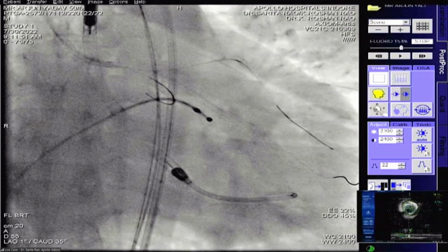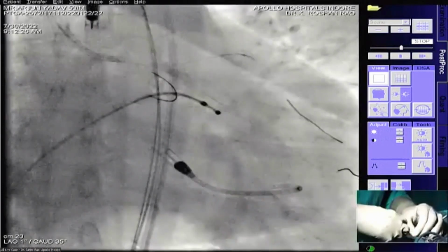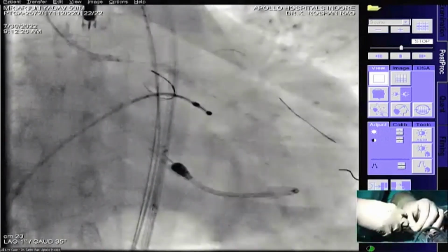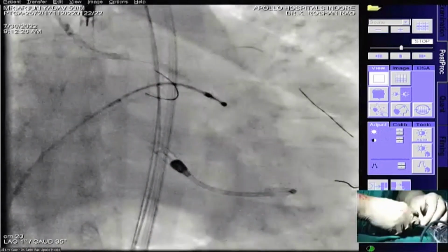Sorry, we did lose you for a little bit. What happened when you inflated the balloon? You said something, patient became bradycardic? So the pressures, we had a flat line on the pressures. The rate started decreasing. I have a temporary pacemaker in for backup too. I think at that time, essentially the entire impeller was inside the ventricle. So it was not giving you good hemodynamic support as we want it to be. So pulling it back definitely will improve. Yeah, I think that helped. The second thing is we took a bolus at that time. The pressures came back pretty fast.